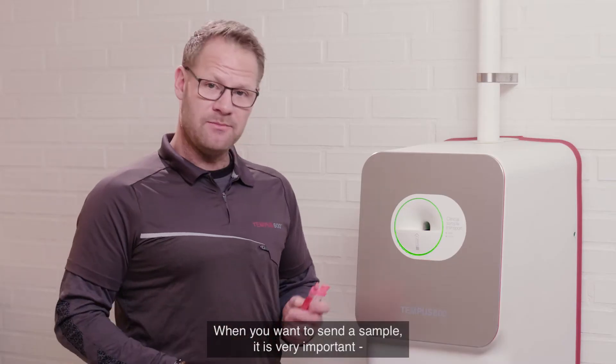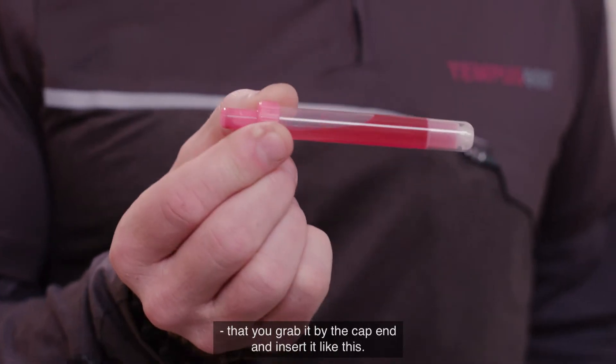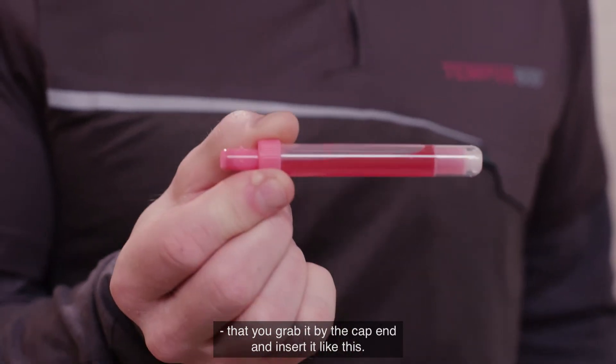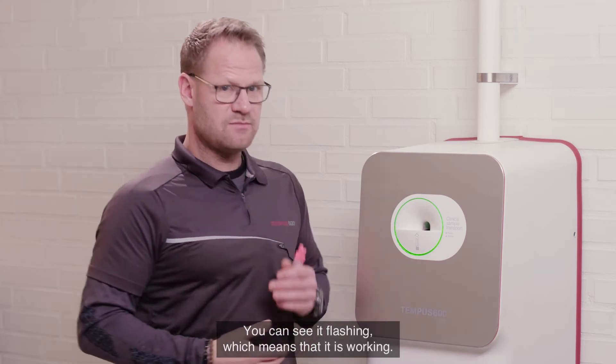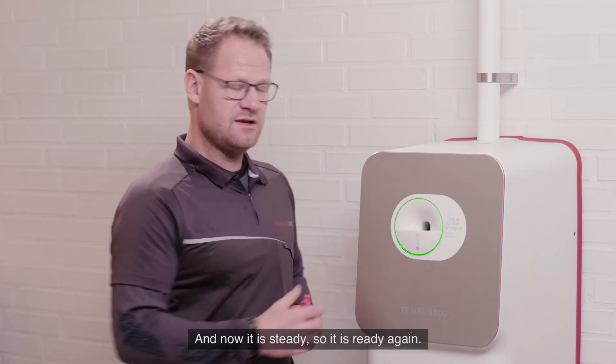When you want to send a sample it's very important that you grab it by the cap end and insert it like this. You can see it flash — it means it's working — and now it's steady, it's ready again.